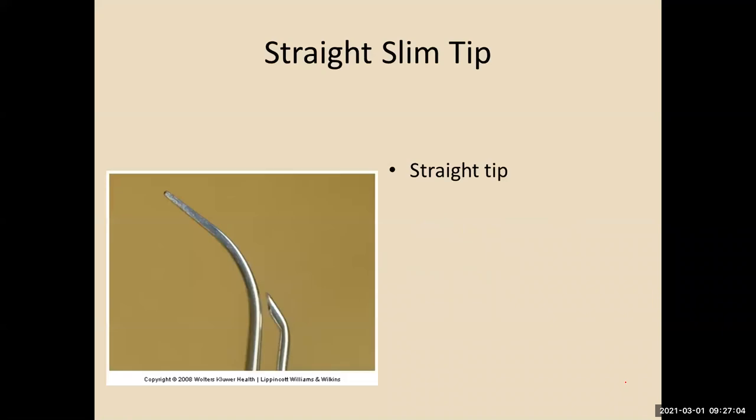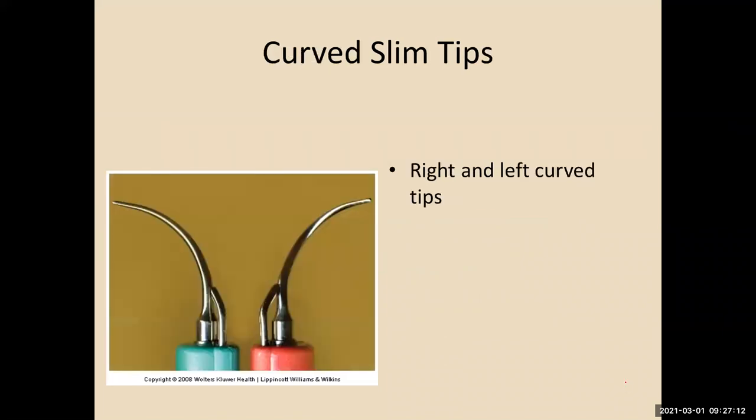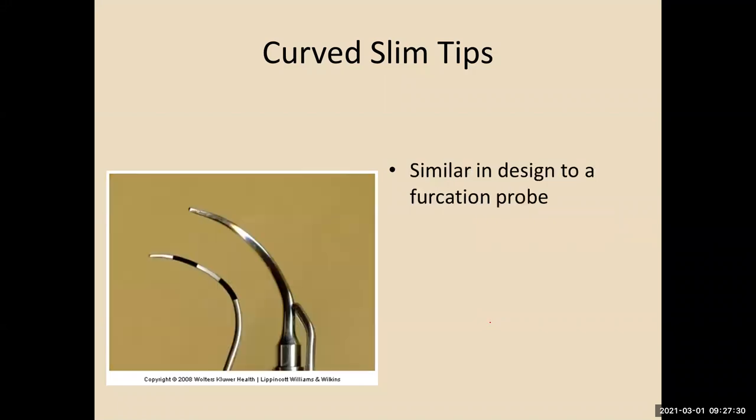You've got your straight tip. You've got a green straight tip. It's a slim line. You've got your left and rights. Again, what you don't want to use is this part next to the tooth. So you need to make sure you're using the proper working end. Furcation.